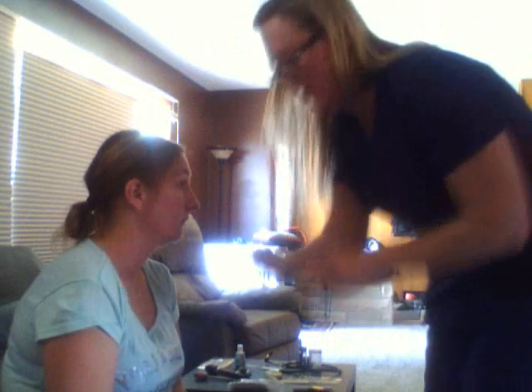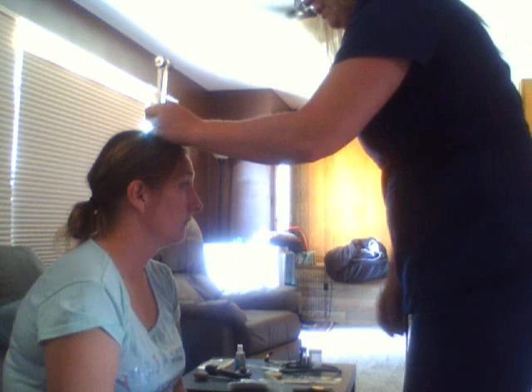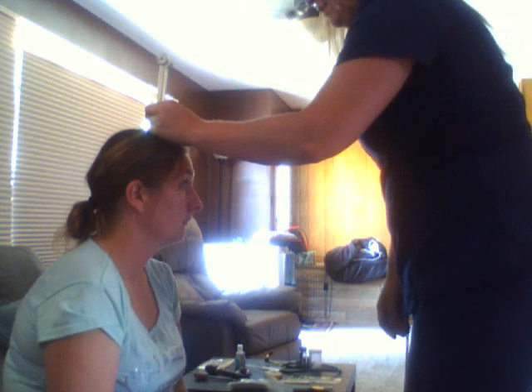Okay, so I am going to hit this part of my hand. I have to do it that way. Can you feel vibration? Mm-hmm. Okay, tell me when it stops. Okay, so that is within normal.